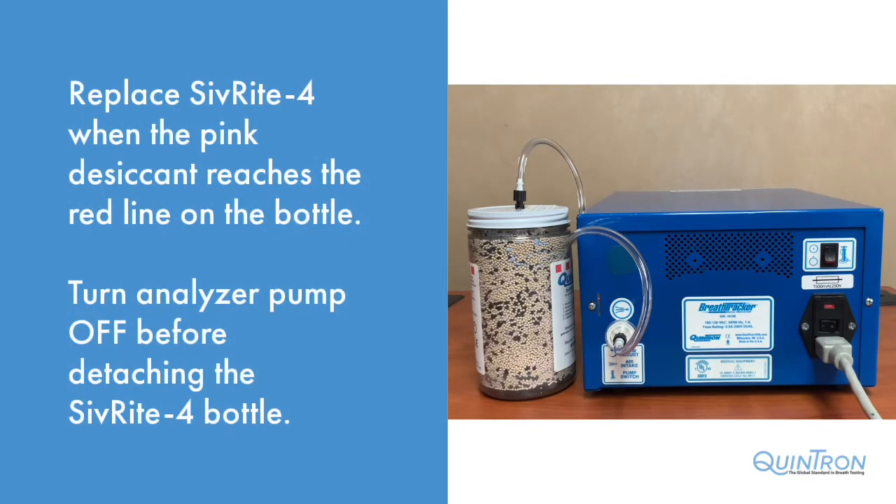To properly maintain your breath tracker analyzer, from time to time you are going to need to change the Sivrite 4 bottle attached to the rear of the analyzer. The blue desiccant within the bottle will change to pink, and when it does to the red line on the bottle, we will disconnect the bottle and replace it with a new one.